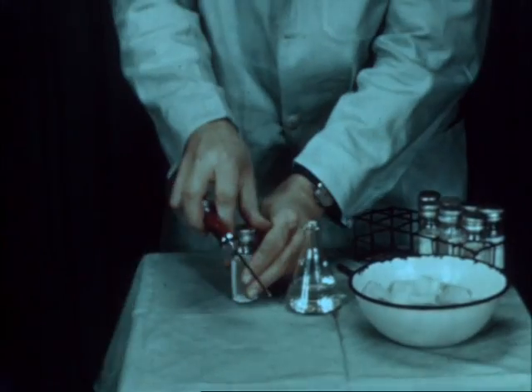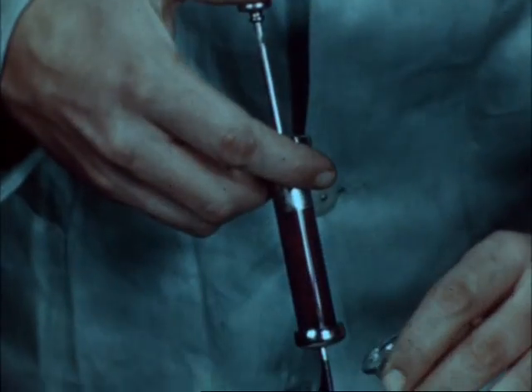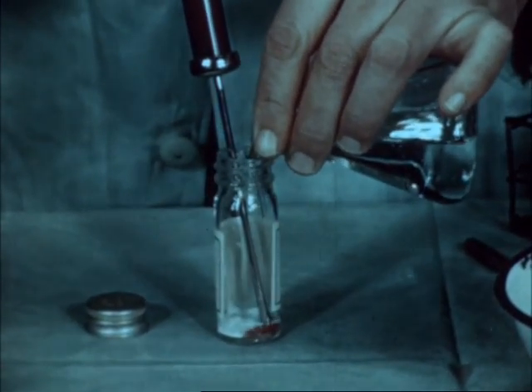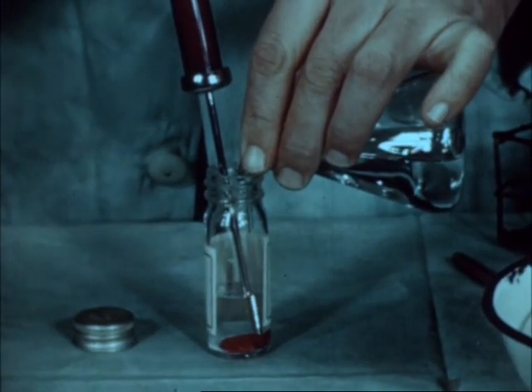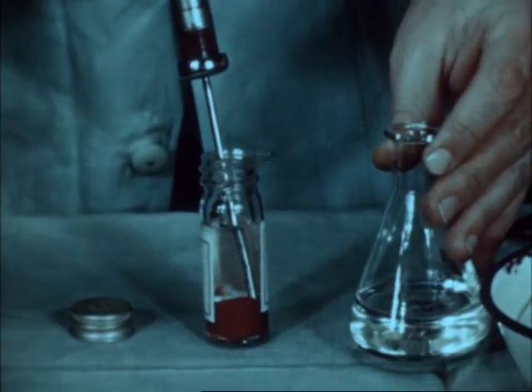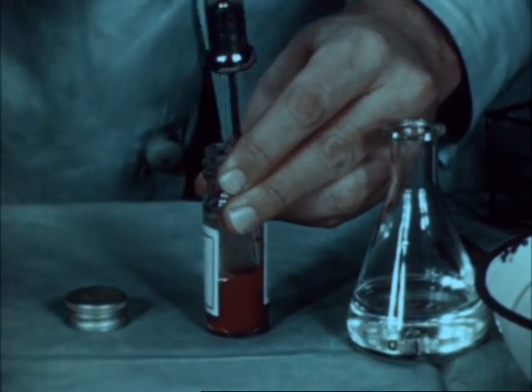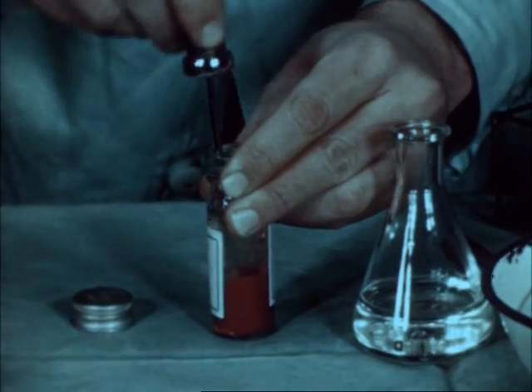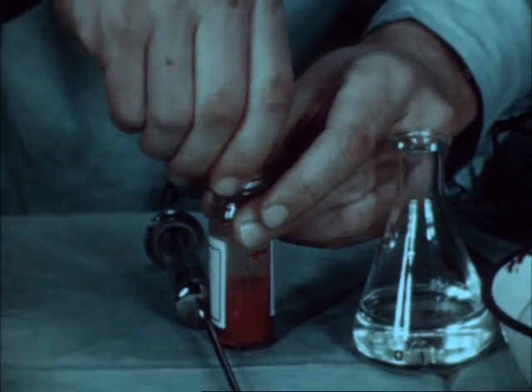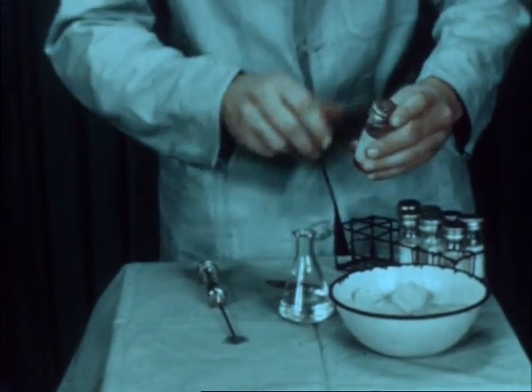Each sample is ejected from the syringe into a bottle containing dry sodium oxalate, and significant contact with the atmosphere is prevented by adding a layer of gas-free liquid paraffin. The sample is then stirred under the paraffin to ensure that the oxalate goes into solution and thus prevent clotting of the blood. The samples are numbered and kept on ice until analysis can take place.